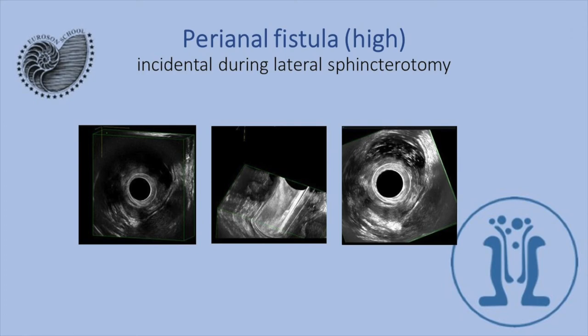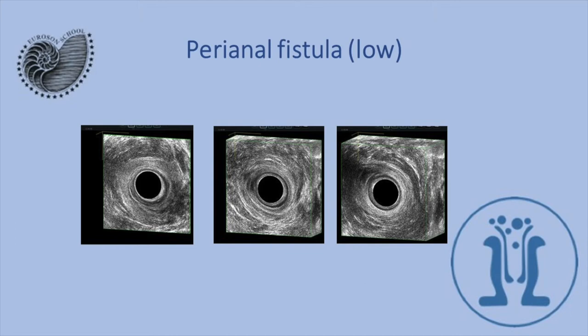Here we see a high anterior fistula which was found incidentally during an internal sphincterotomy. Here is the fistula. And here is a low anal fistula — we see the deep position of the external sphincter at the deep level, the internal opening, and the external opening of the anal fistula.